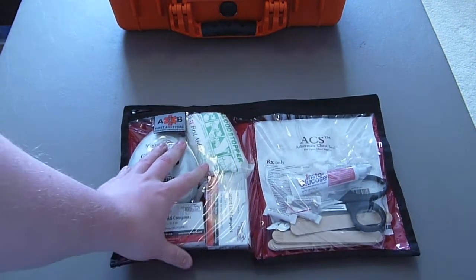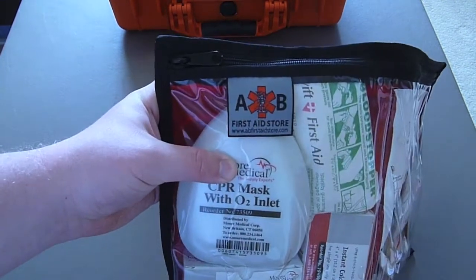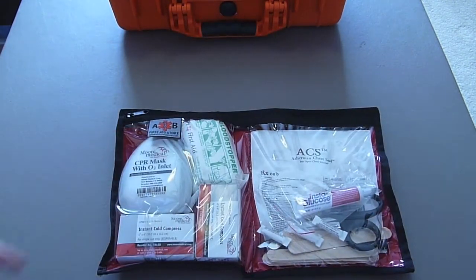Here we have a two-pocket little pouch. This pouch and the main folding-out pouch that you'll see later in this video are made by a company called AB First Aid Store, and these pouches are made specifically for the Pelican 1500 case.